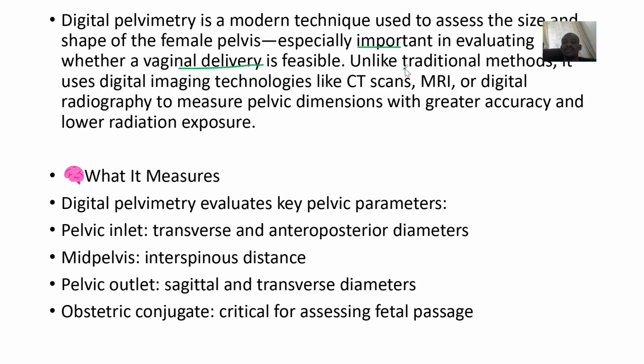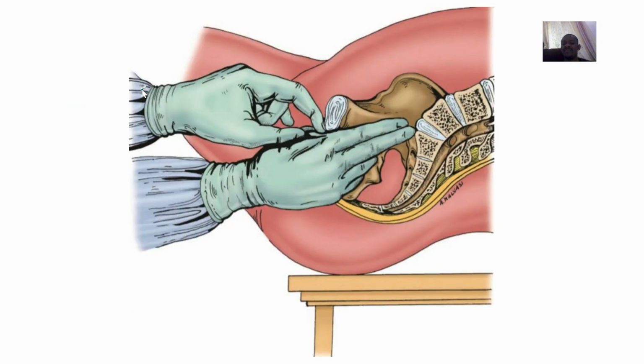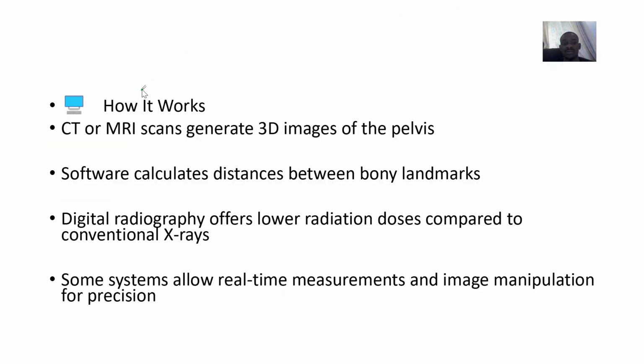Do you understand? So unlike traditional methods, it uses digital imaging techniques, like CT scans, MRI, digital radiography. So this will help them have a very good view of the pelvis, to know if you can be able to deliver the baby through the pelvis or not.